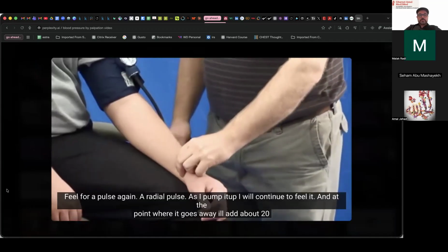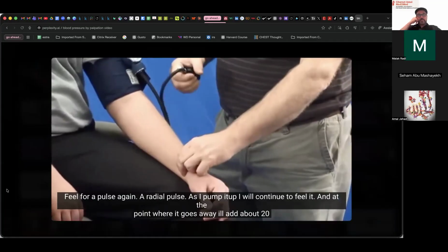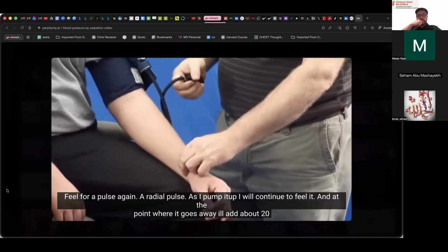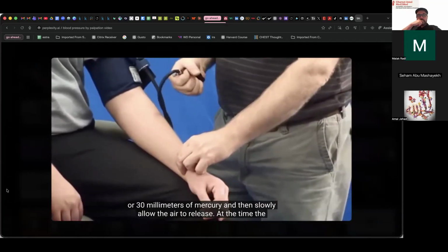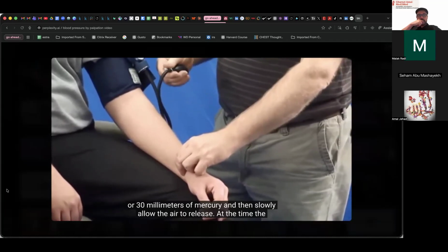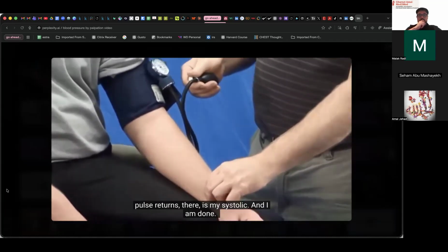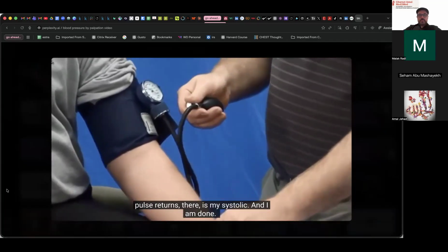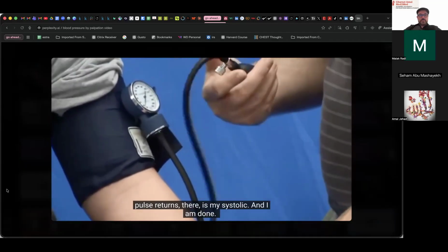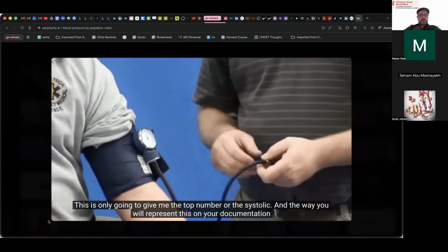Feel for a pulse again, a radial pulse. As I pump it up, I will continue to feel it. And at the point where it goes away, I'll add about 20 or 30 millimeters of mercury and then slowly allow the air to release. At the time the pulse returns, there is my systolic, and I'm done. This is only going to give me the top number, or the systolic.